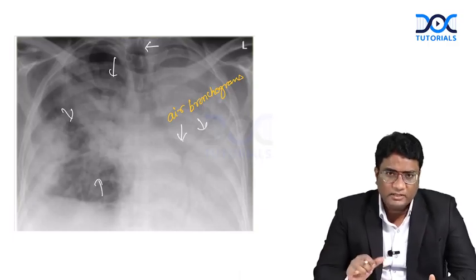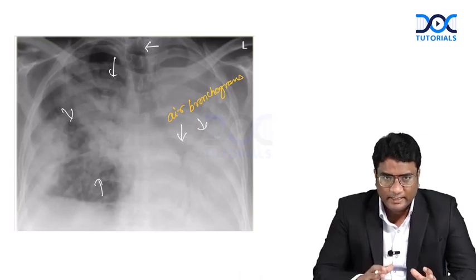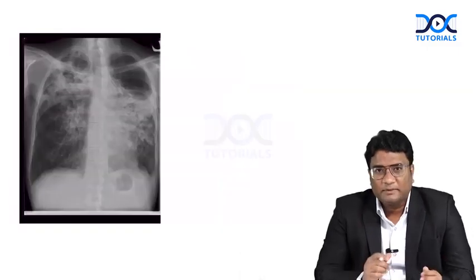So this is how you see the pneumonia or consolidations. Ill-defined fluffy borders, no tracheal shift, presence of air bronchogram through the opacities. All of this tells you this is pneumonia or consolidation. And look at this image.